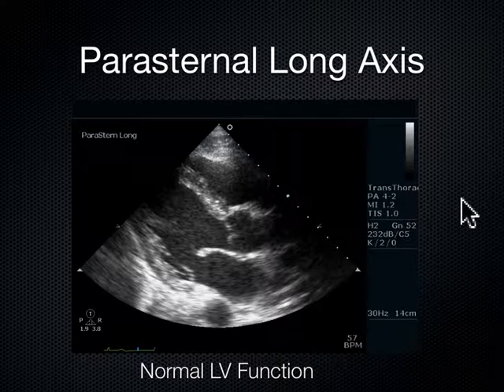So one thing you can do, if you want to take the time to do it, you can actually measure the left ventricle at the end of diastole, and you can drop some calipers that we call discs through there. There's several ways to do it, but you can imagine you could trace the area of the left ventricle cone at the end of diastole, do the same thing at the end of systole, and the machine will calculate the ejection fraction as an actual number.